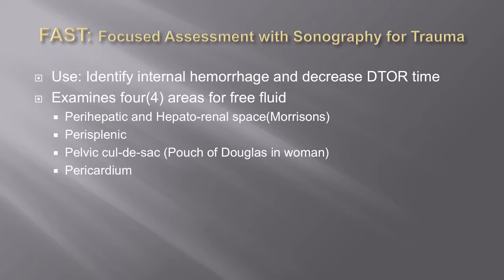And what it does, it replaces something called a DPL, Diagnostic Peritoneal Lavage. You guys know what that is? You shouldn't, hopefully. It's a very barbaric way that we would tell, back in the days, if a trauma patient had intra-abdominal hemorrhage.